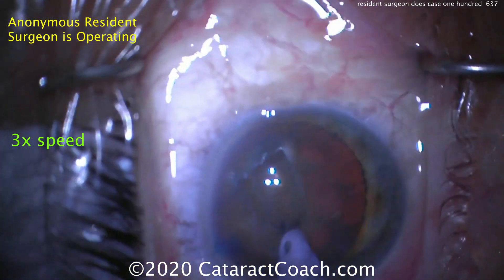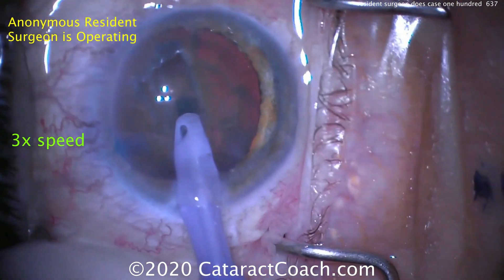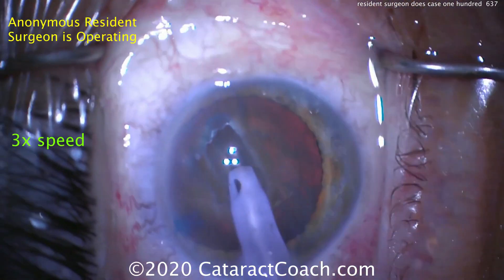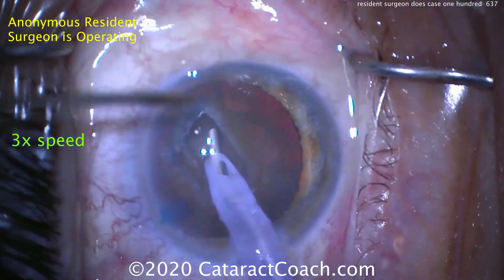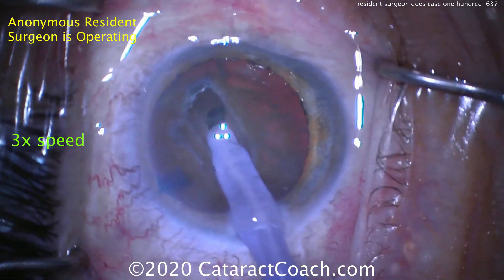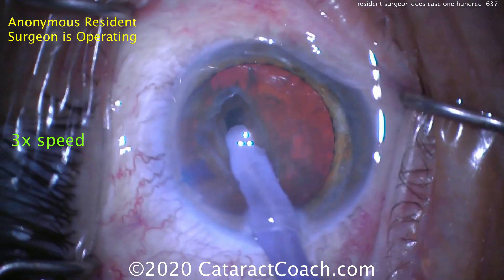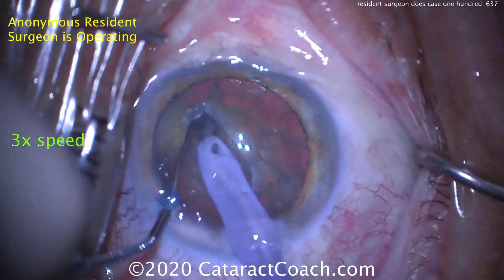It looks like a central groove is being created in the nucleus. That looks pretty reasonable. Nice central groove — there it is. Remember the M&M shape of a human lens, of a cataract: thicker in the middle and thinner in the periphery. So when you make this groove, make sure it's a little deeper in the center and a lot more shallow in the periphery.